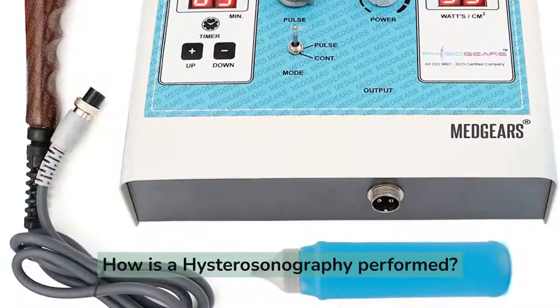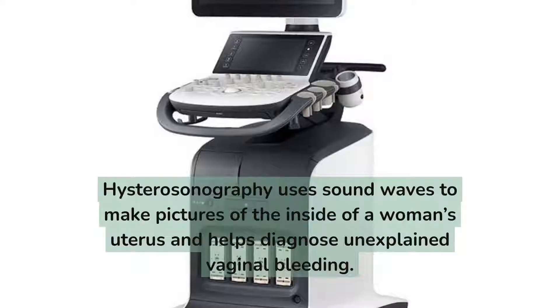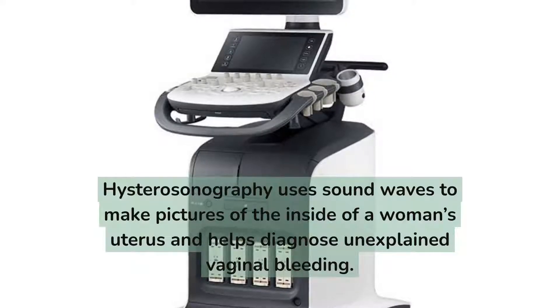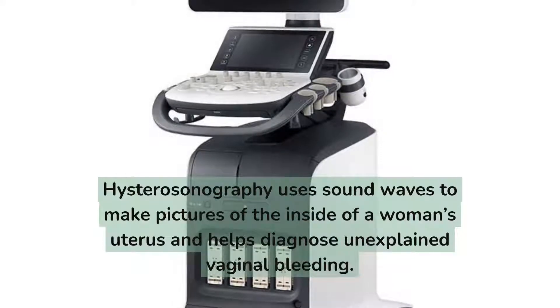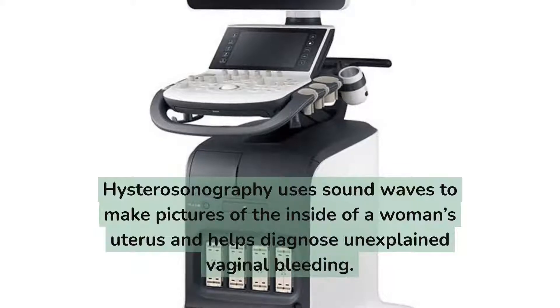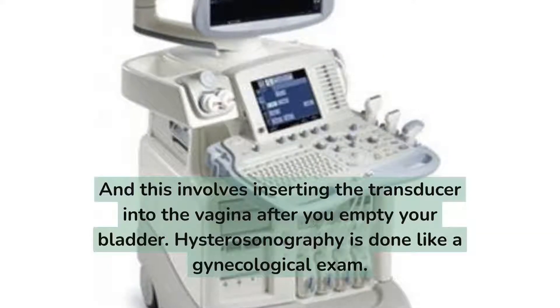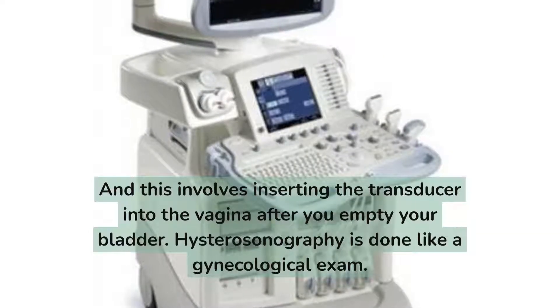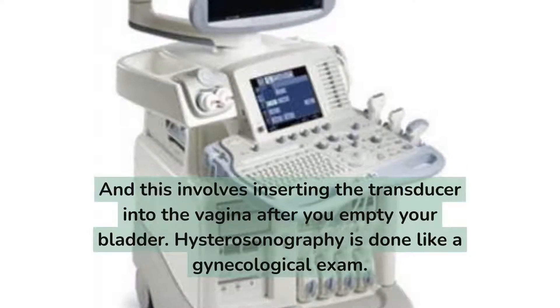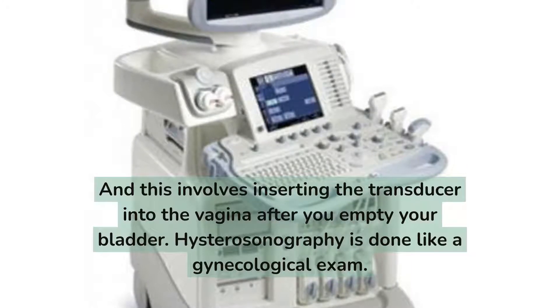How is hysterosonography performed? Hysterosonography uses sound waves to make pictures of the inside of a woman's uterus and helps diagnose unexplained vaginal bleeding. This involves inserting the transducer into the vagina after you empty your bladder. Hysterosonography is done like a gynecological exam.